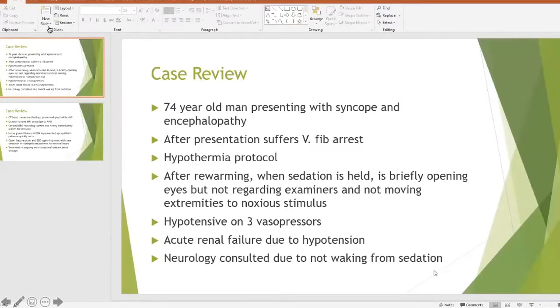Working with both patients with chronic strokes and different types of brain injuries, we see quite a bit of epilepsy here. So whenever I came here 2 to 3 years ago, we had routine EEG with the neurodiagnostics department, but we did not have any form of continuous EEG monitoring. So whenever I heard about Ceribell, I was very, very interested in it. We've been using Ceribell for a little over a year now, and we've had very good results from it. Been very impressed by the technology.